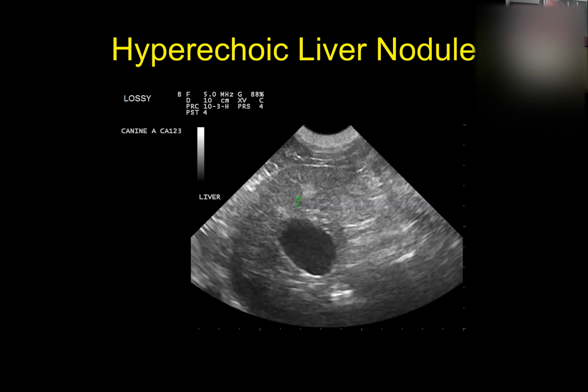On the other hand, if you see a bunch of nodules all over the liver or the spleen, and they're all variously sized, some really big and some really small, and they're more cavitary in appearance, there's a good chance those are going to be malignant. But again, the only way to know for sure would be to put a needle in it and look at the cells under a microscope, or get the dog or the cat back in 2 or 3 weeks and re-look at those suspicious nodules and see if they have changed, if they're bigger, smaller, more numerous, or gone away. Okay.